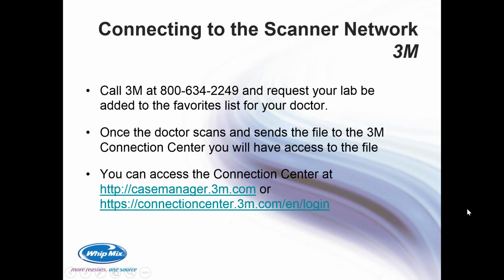So with 3M, connecting to their scanner network, you can call 3M at 1-800-634-2249 and actually request your lab be added to the favorites list of your doctor. And just to give you an idea of the workflow with 3M labs, you can download the case from the 3M Connection Center.